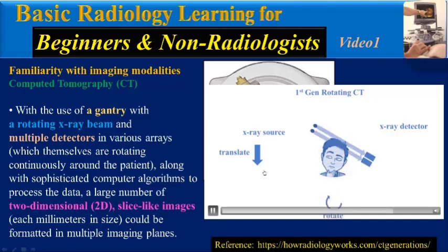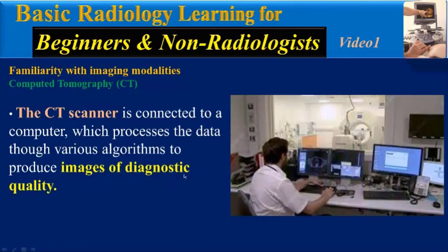multiple imaging planes. The CT scanner is connected to a computer which processes the data through various algorithms to produce images of diagnostic quality.